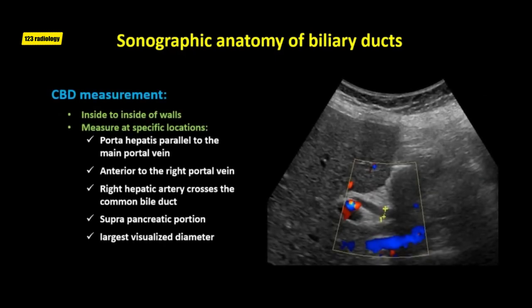The anteroposterior diameter of the common bile duct is measured in the long-axis view, from the inside of the near wall to the inside of the far wall. Measurements can be made at specific locations: at the porta hepatis parallel to the main portal vein, anterior to the right portal vein, at the point where the right hepatic artery crosses the common bile duct, at the suprapancreatic portion prior to the taper of the pancreatic head, or at the largest visualized diameter.